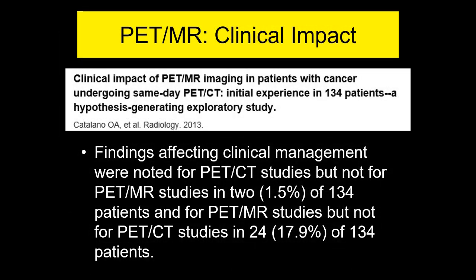So what is PET MR's clinical impact? There have been very few studies actually looking at the true impact of PET MR and comparing PET MR to PET CT. One of these early papers took all incoming patients, who got a PET CT and a PET MR, and then they decided to see in how many cases PET MR added value.